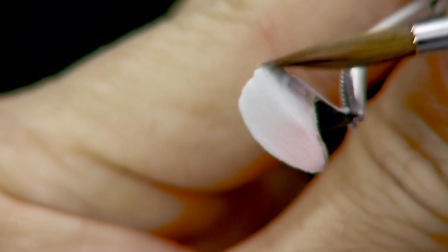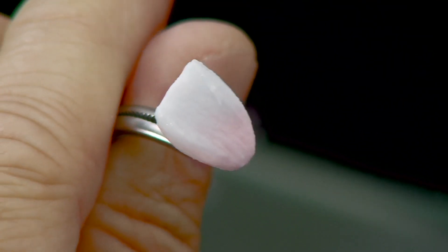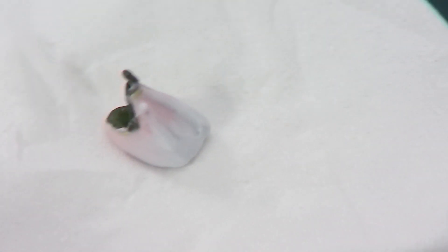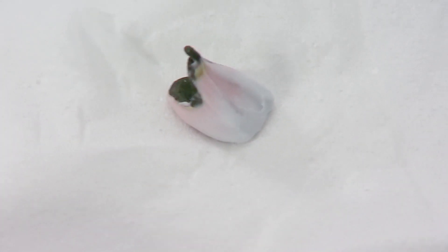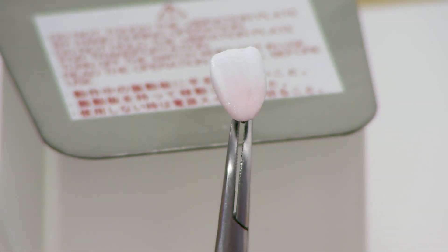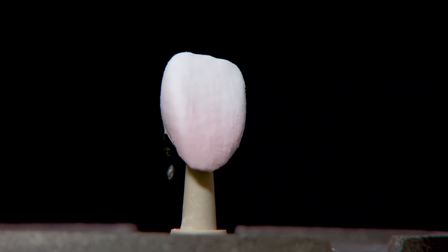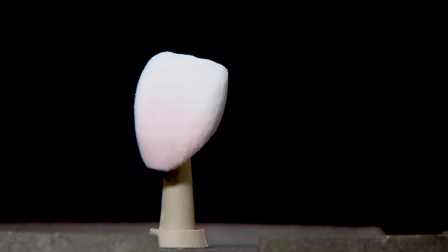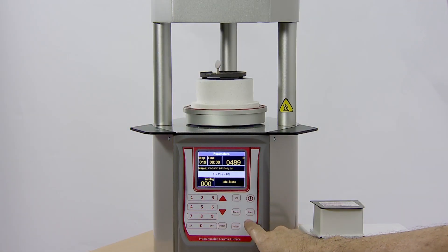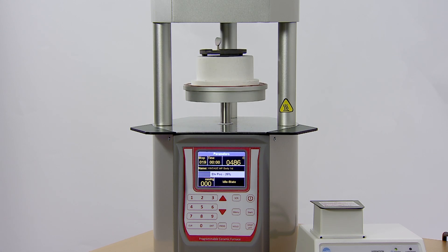Add body and enamel porcelain to insufficient areas, especially at the contact and cervical areas. Remove any excess moisture with a tissue paper, then check and clean the internal fitting surface of the crown with a small dry brush. Condense the crown on the Ceramo Sonic S condenser and remove excess moisture. The buildup is complete — select the appropriate firing program and fire the crown.